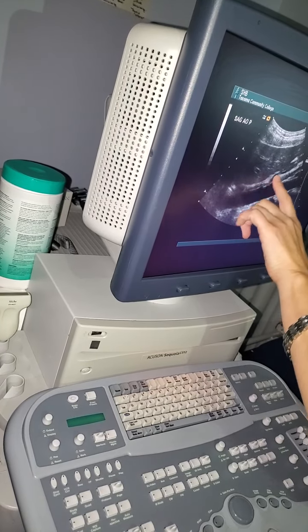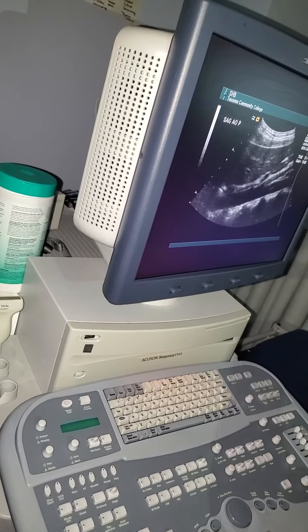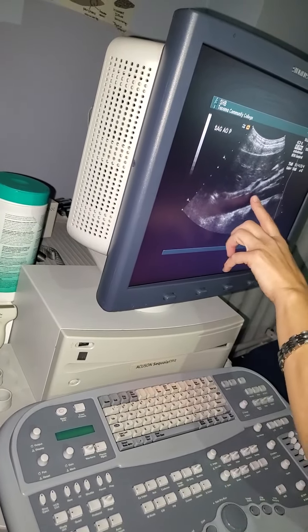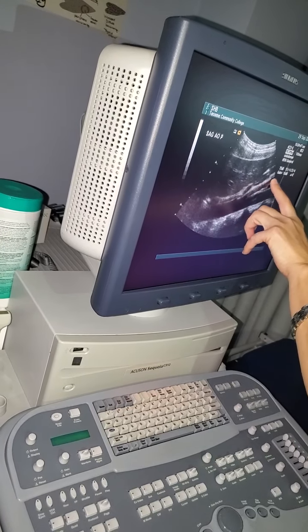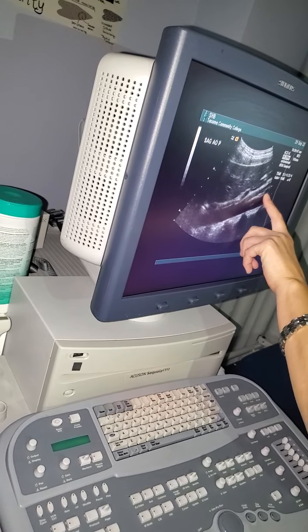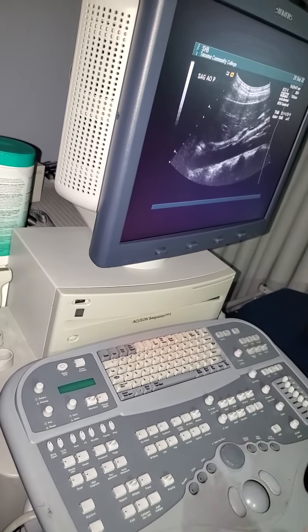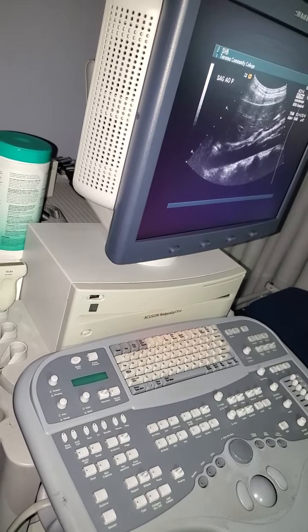And then the SMA. The celiac just kind of looks like a big lump here, because remember, the hepatic artery's going this way, splenic's going that way, and so the SMA always follows that aorta anteriorly, and then we're going to run into the left renal vein. Okay.